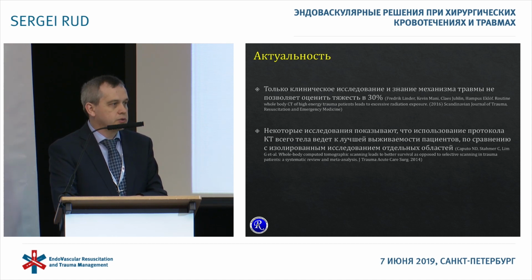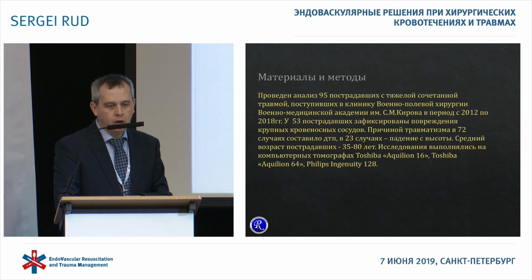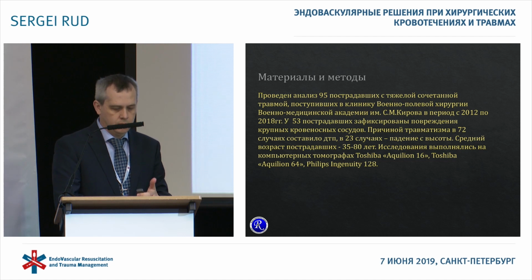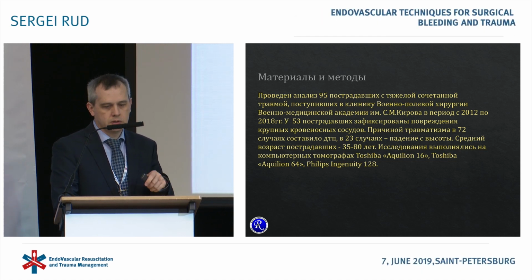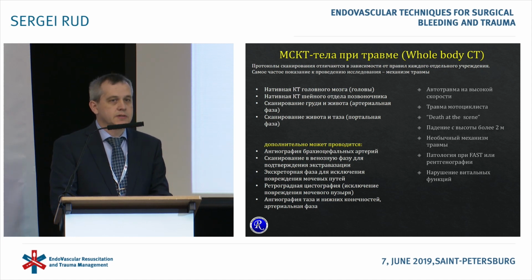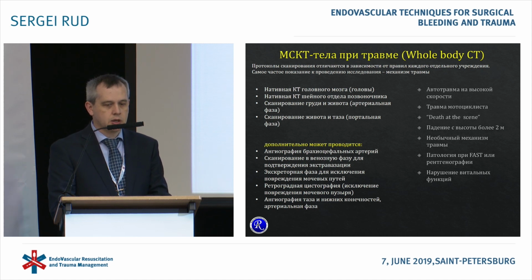The whole body CT protocol gives better results and outcomes in patients with trauma compared with CT of selective regions. We do not have such a huge experience of such studies, but we carried out the analysis of our series. When providing medical care to these patients, the organization of the process is crucial. The CT protocols, depending on the equipment different institutions have, may differ as well, but not significantly.